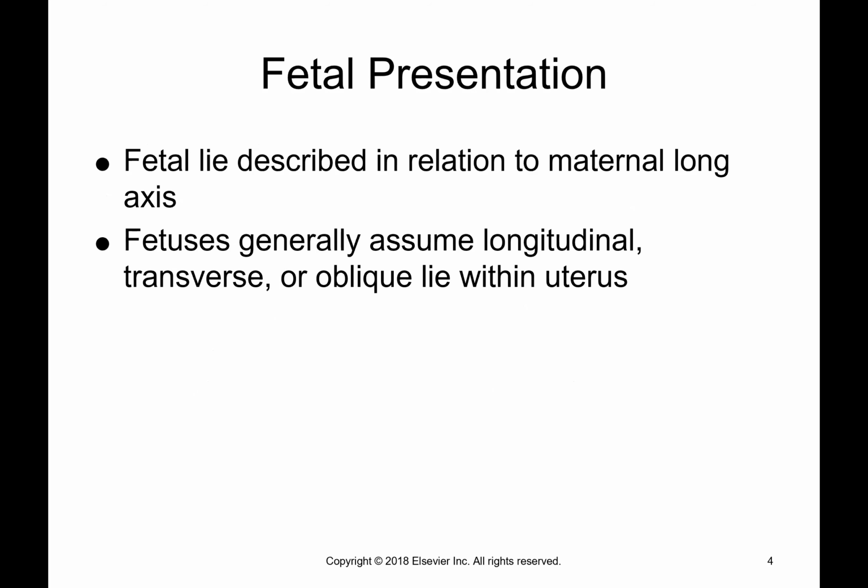Now, what I really want you to know, and this is the first thing that we're going to work on when we get patients into the OB lab, is fetal presentation. And fetal presentation is basically how the baby is laying in there. And this is so important because once you can visualize how the baby is laying, it's easier for you to scan because in your mind's eye, you kind of know where to go to get a certain thing. So that's the first thing that we're going to work on.